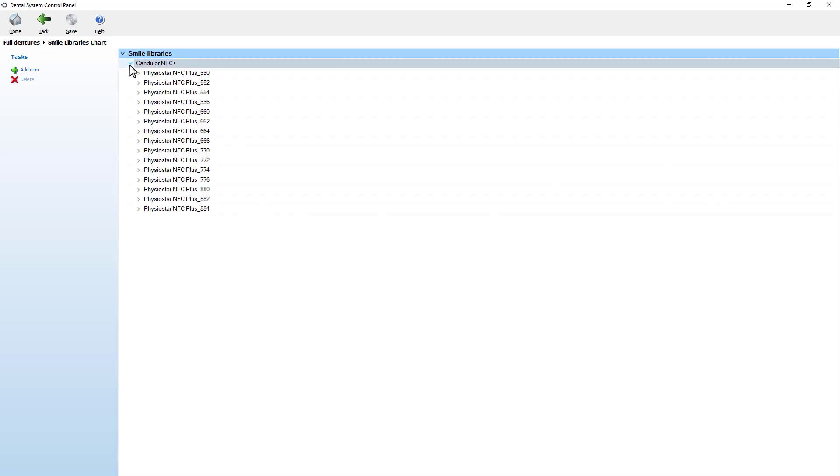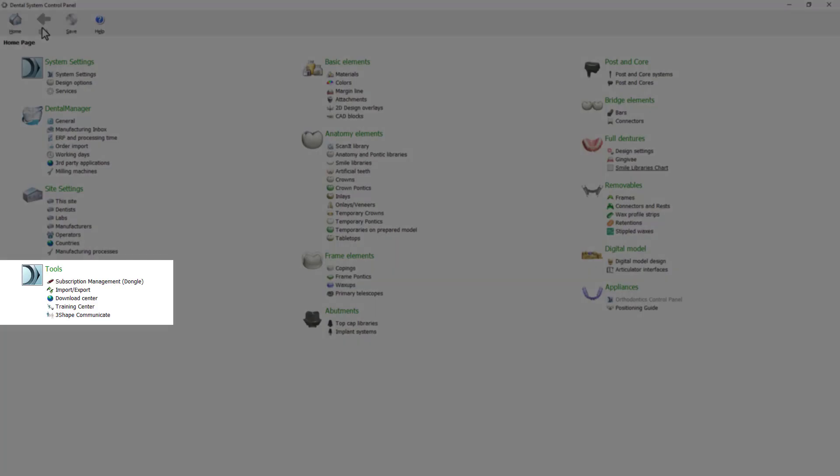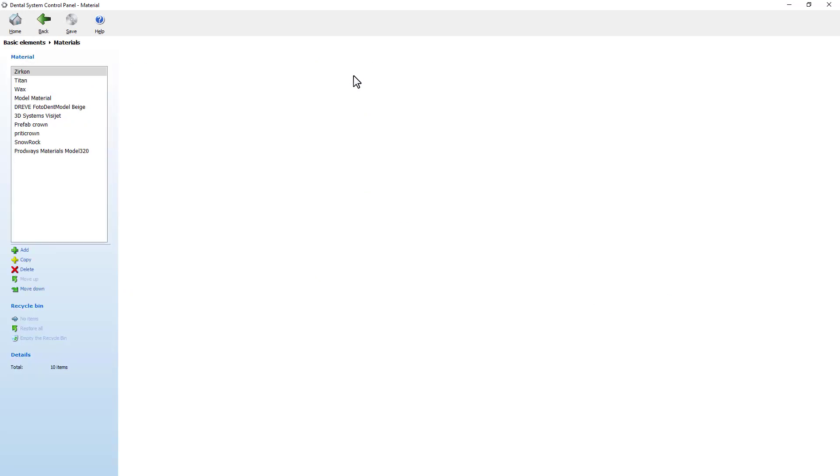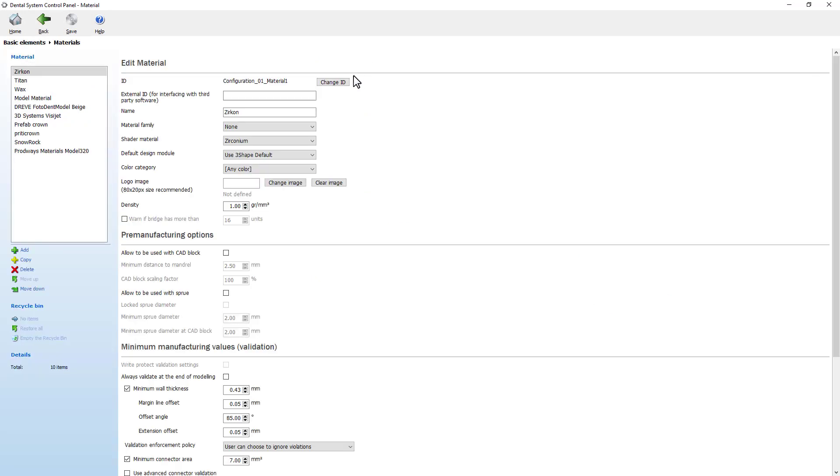To be able to download more, go to our download center in the tools menu. You can also pre-define the material used for manufacturing the final restoration in the basic elements options.